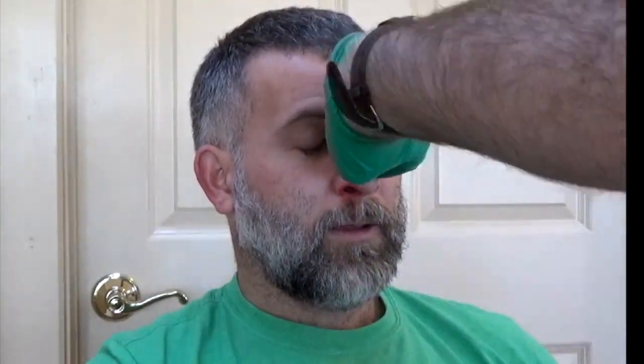Next, gently remove everything except for the absorbable hemostatic packing that's still in their nostril. Apply some benzoin along the side of the nose and the very bottom of the septum, and put a steri-strip on which will hold the packing in place.